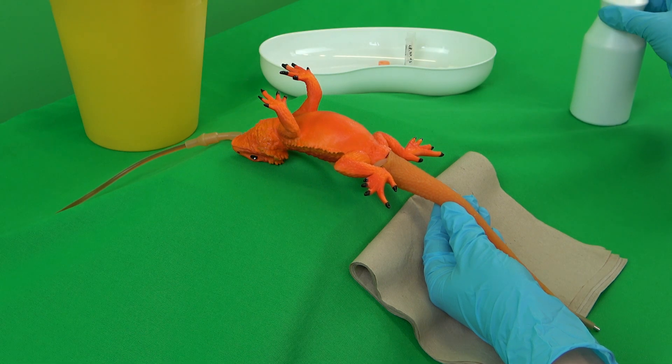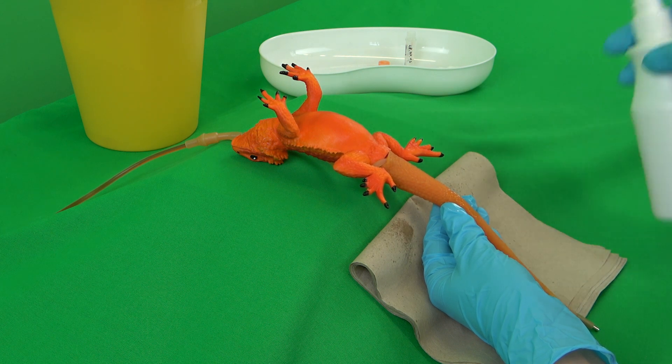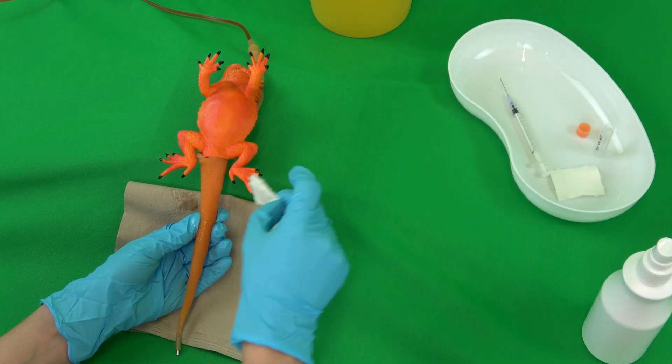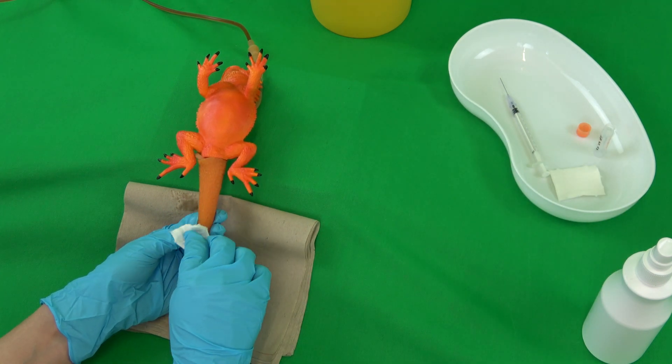Next, the puncture site is disinfected and dried with gauze swabs. The puncture site is wiped with the swabs in line with the flow of the scales. If necessary, further swabs may be used in the same way.